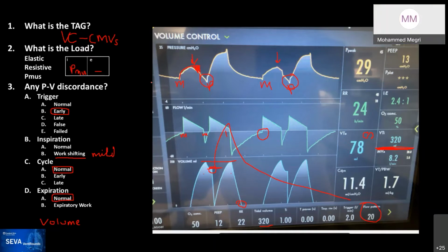It depends on why the patient has early triggering. If it's over-sedation or something like that, I would start with decreasing patient sedation and see if that helps with the reverse triggering. But if there are other reasons, or it's because of the timing of the I-time, I try to fix the mechanical ventilation settings and see what exactly the patient wants. Sometimes I put them on pressure support to see what volume the patient wants and what the I-time is, and then try to mimic that, making sure I do not go outside the lung protective umbrella to keep the patient safe. That's how I do it. I don't know if that's right or wrong.